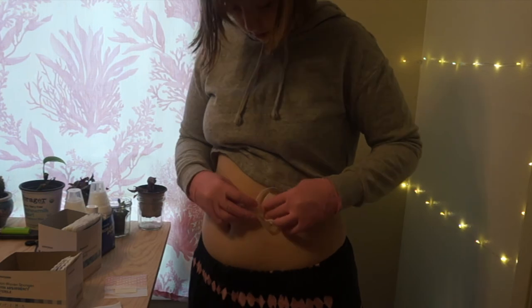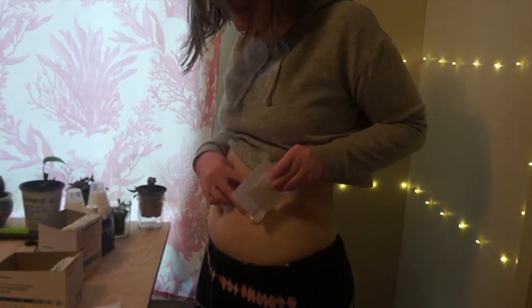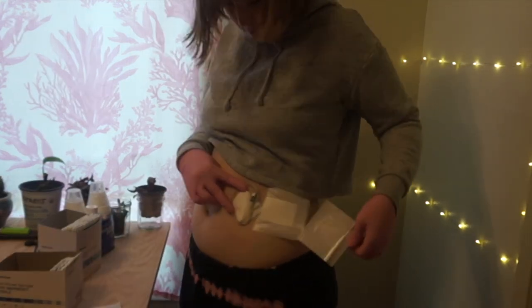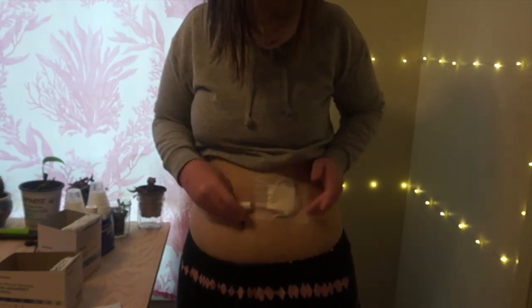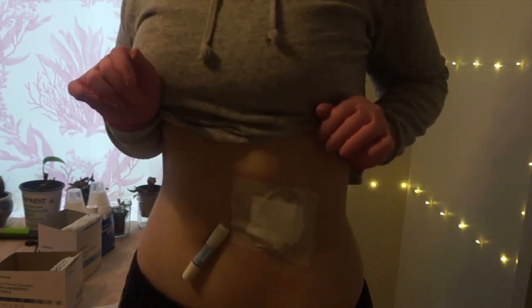I found this to be more comfortable and the least bulky. If you want to try this, I will hopefully be coming out with a little step-by-step sheet on my Instagram, so you should be able to follow it and ask for supplies at your dialysis clinic.